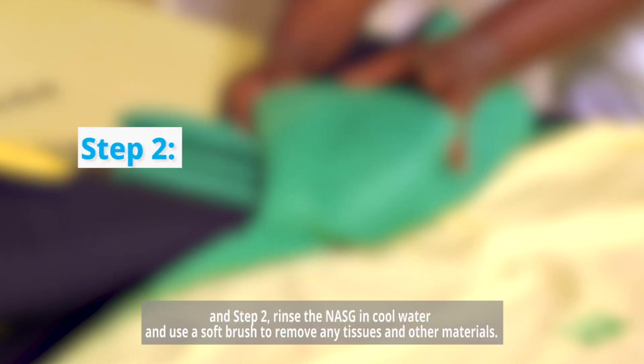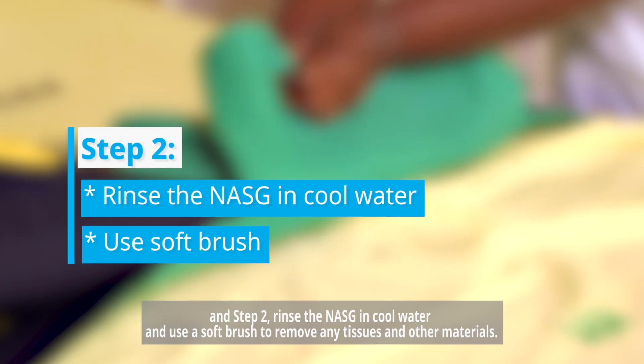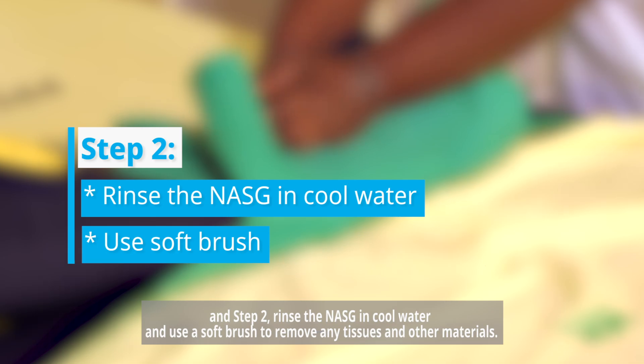Step number two: rinse the nasig in cool water and use a soft brush to remove any tissues and other materials.